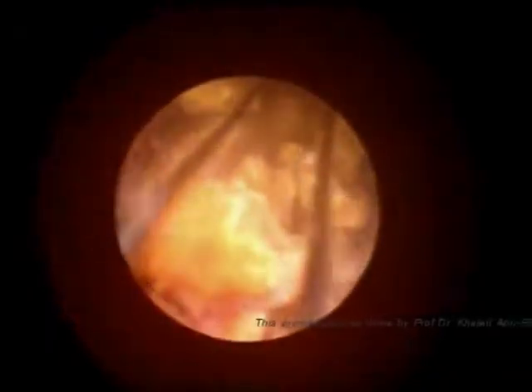Now the stone is inside the dormia and our laser fiber will start fragmentation. This is the laser fiber, and this is the fragmentation of the stone with the laser. You can see the fragments of the stone within the dormia.